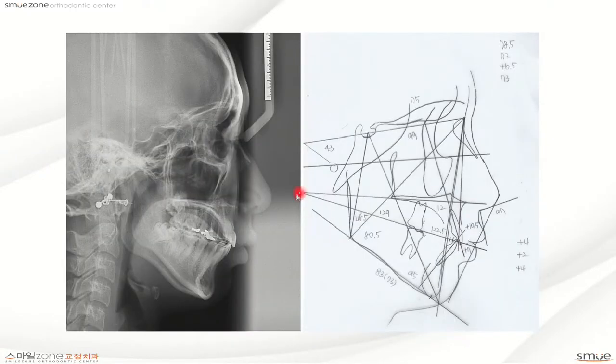Yeah, so look at the position of the upper incisors, in the center of the palatal bone.